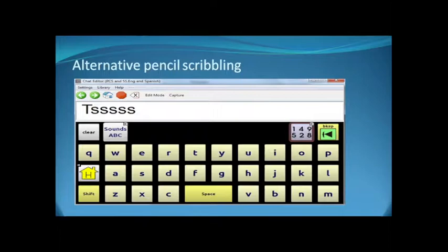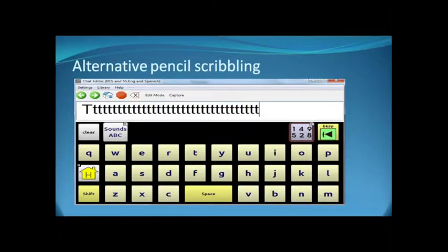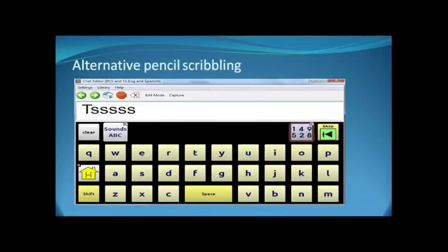So now, back to this one, it's like, oh, you got all the T's for Tess. Okay, what's that last sound? Oh, we got S's in there. So now the next time she's doing T with S's on it. So she's getting closer, right?